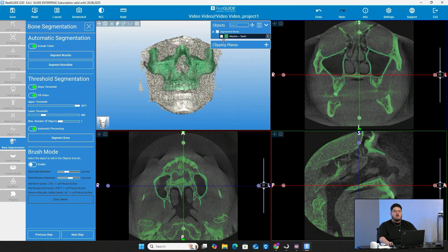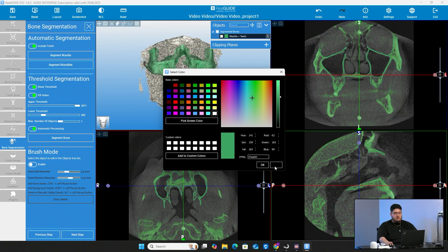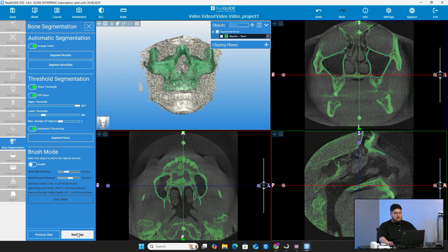If you want to go ahead and change the color, you can come right here to your object list, go to the three lines on the right side, and change the color to whatever you want. You can see the segmented bone right there in the actual CBCT scan. What you want to do now is go to the bottom left and press next step.